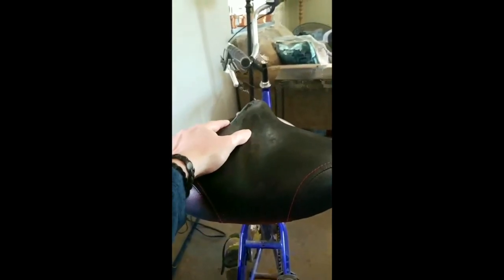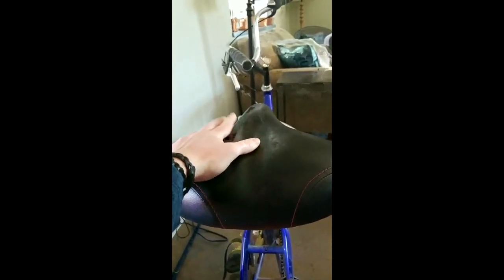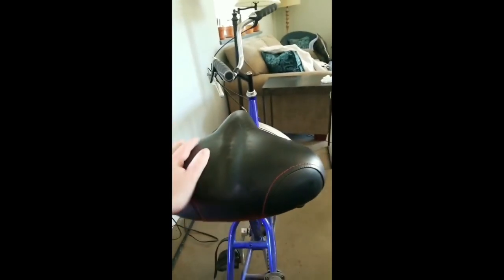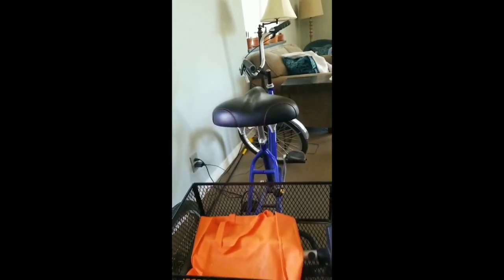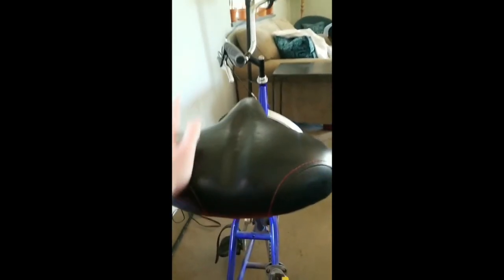And the seat is also pretty large. The prosthetic side kind of hits it a little bit, but it's a good shape in order to make it comfortable for me. Prosthetic basically goes all the way up to the butt bone, so it does kind of interfere if you have like a different shaped seat. So those are all of the modes of transportation that I use in order to get around throughout the day.